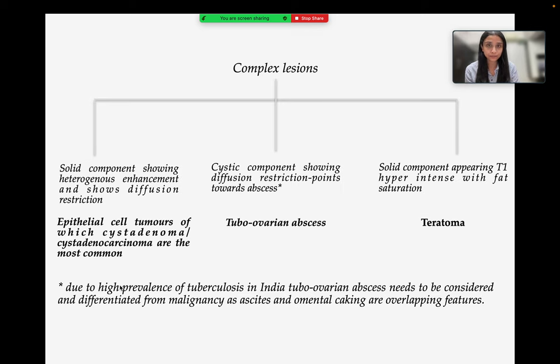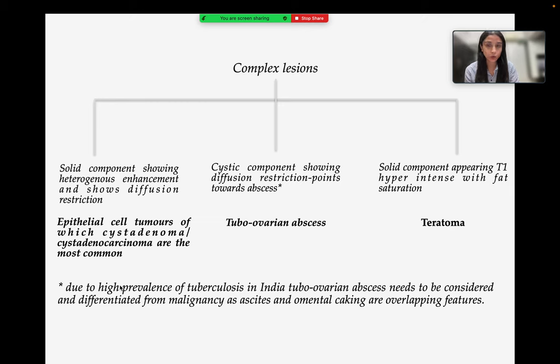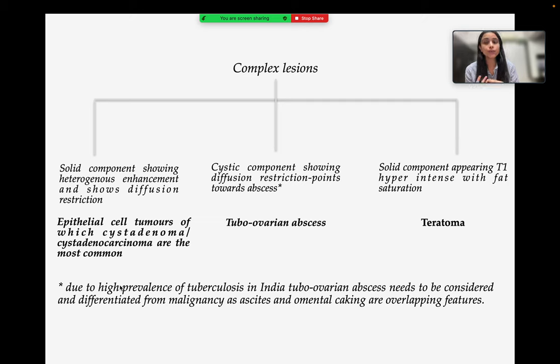When a complex lesion has a solid component showing heterogeneous enhancement and diffusion restriction, it indicates epithelial cell tumors, of which cyst adenoma and cyst adenocarcinoma are most common. If the cystic component shows diffusion restriction, it points toward abscess, suggesting tubo-ovarian abscess. Due to the high prevalence of tuberculosis in India, tubo-ovarian abscess needs to be considered and differentiated from malignancy, as ascites and omental caking are overlapping features.